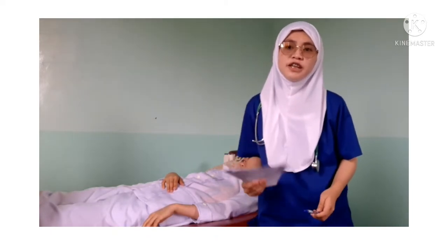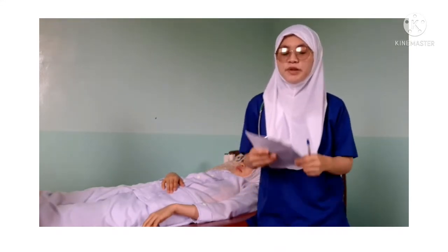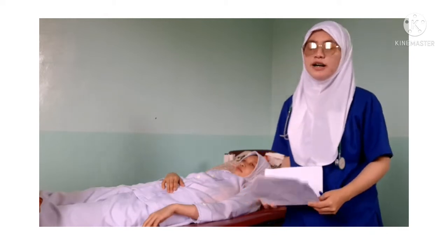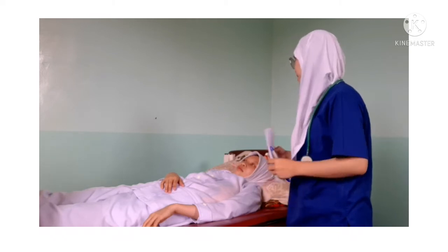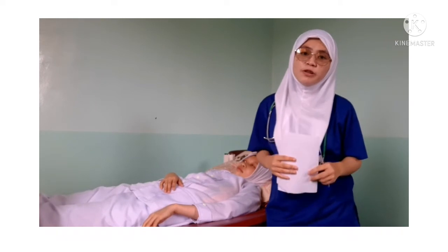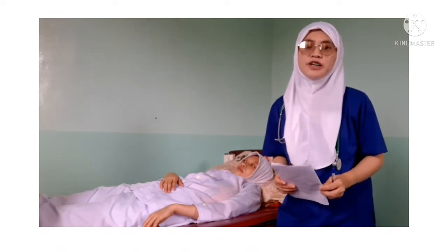First, check the doctor's order to avoid errors that may have occurred. And now, explain the procedure to the patient. So, ma'am, I am Siti Bashma, and I'm going to get a sputum sample from you. Is it okay with you? Optimal results are achieved when the patient is given pre-treatment instructions. And next, gather necessary equipment to save time and effort.